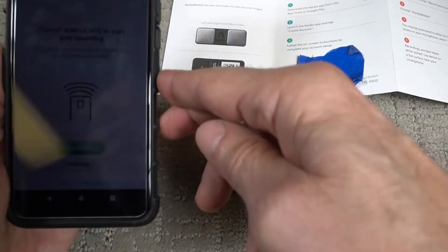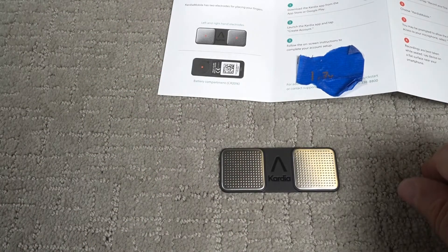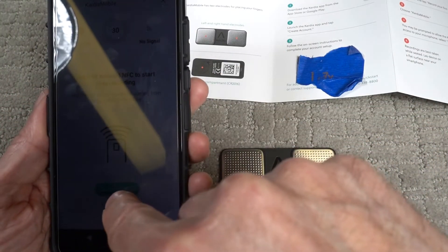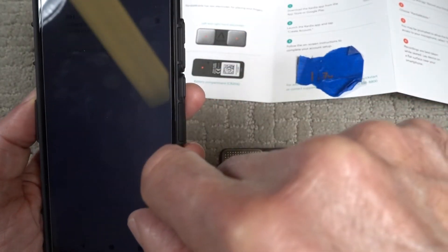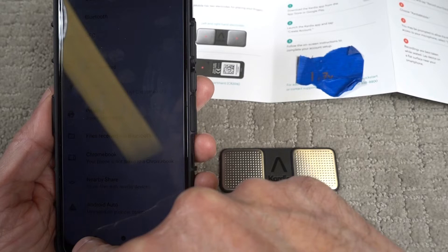Turn off Android NFC to start your recording. NFC interferes with the signal coming from your Cardia mobile device. Let's turn off Android NFC — go to settings, NFC is right there, I'm going to turn it off, then go back.